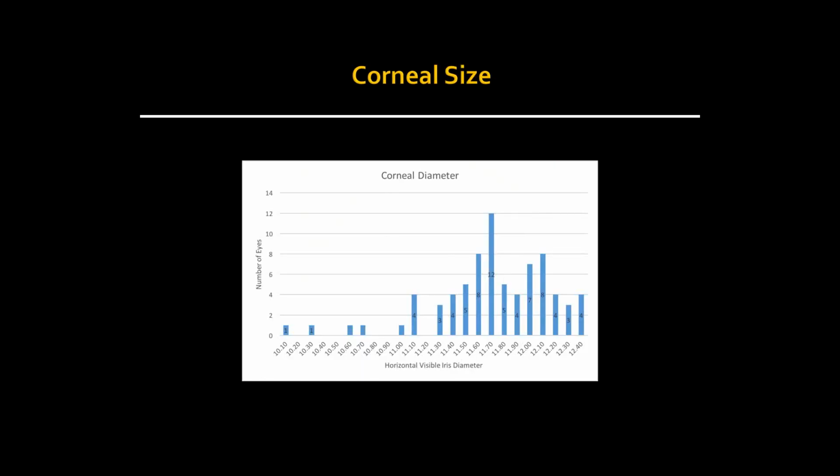Now, with this specific cohort, I know we've seen these distribution charts before. This is not new, but I wanted to see whether the distribution of the population we used in the study follows what's typically average. Average size runs anywhere between 11.5 millimeters to 11.9 or 12.0.